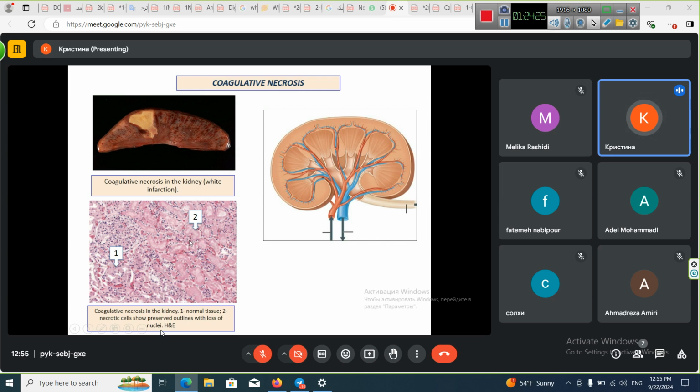They are cell nuclei of loose fibrous connective tissue and blood vessels. But we are talking about the death of nephrons. Nephron cells are here and they contain no nuclei. It means that they are dead.